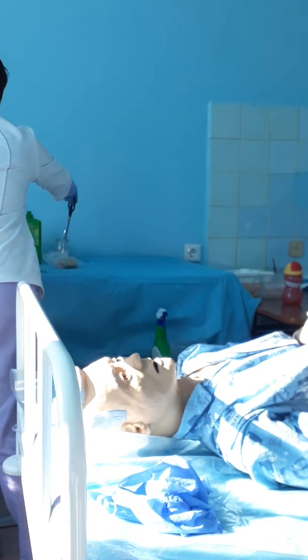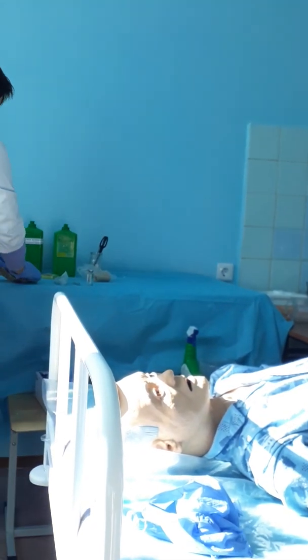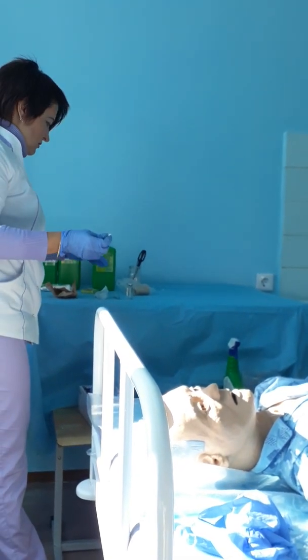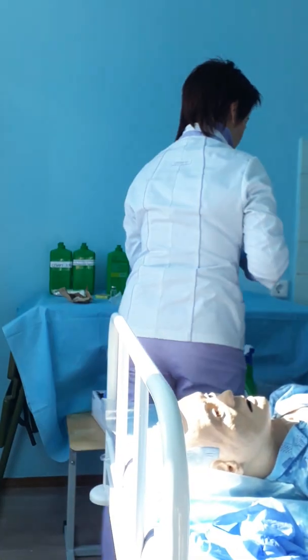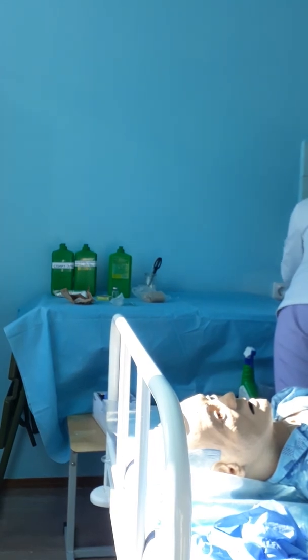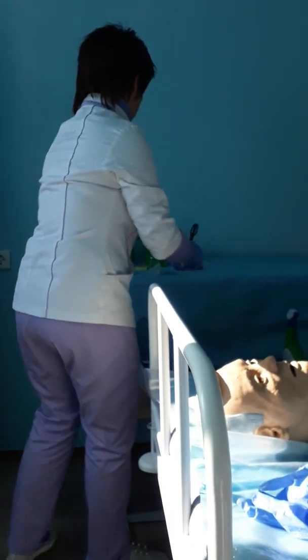Now, if needed, you open this vial and again clean only the stopper, only the top. Okay. Wait some time and the solution will dry. And prepare your syringe.